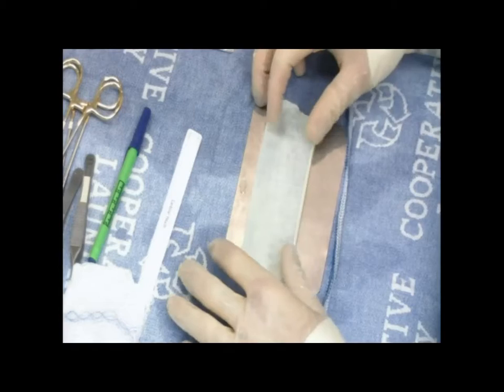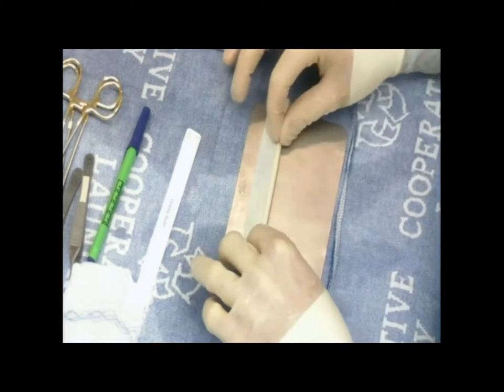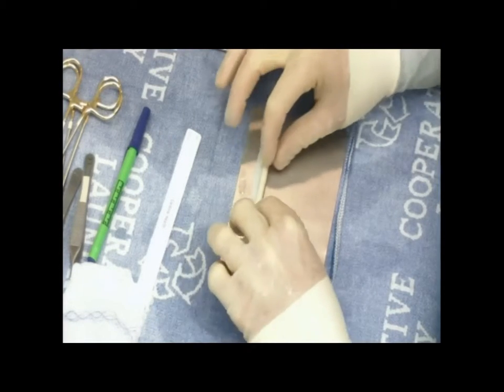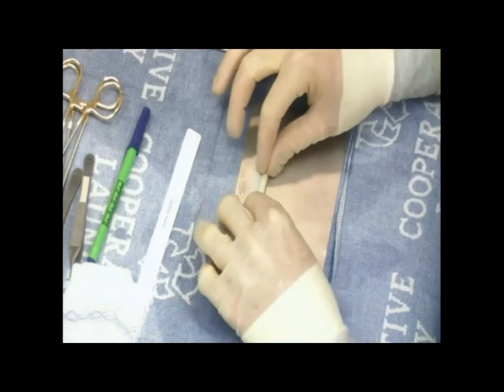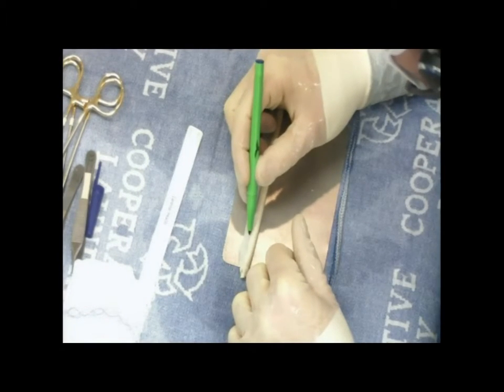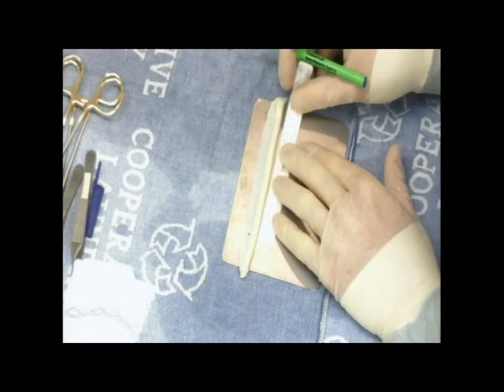This is preparation of a frozen fascia lata allograft. We've already rolled the graft to determine its consistency and to look at it to see where we can find the most uniform segment. I've determined the graft length intraoperatively — the length of the defect on the acetabulum — and then overestimating this so that I can cut off the excess in the joint.